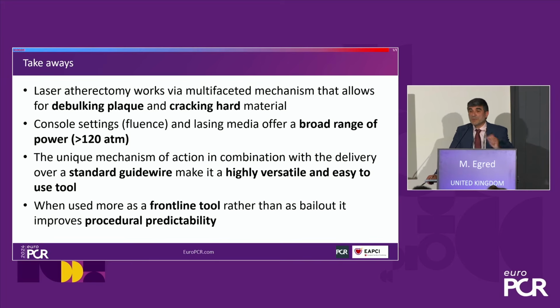But basically, what we have seen in this session is that laser atherectomy is quite effective, and it has a multifactorial effect, three mechanisms of action that allow you to change the complexion of any lesion, debulking it and also cracking the hard lesion. And many times, as we've seen from the show of hands, a lot of you have tried multiple techniques that we all know, the small balloon, extra support wire, and guide extension, and it is still unsuccessful. The only way to do it is by using the laser, because once your angioplasty wire has passed, you know that the laser will allow you to do this.